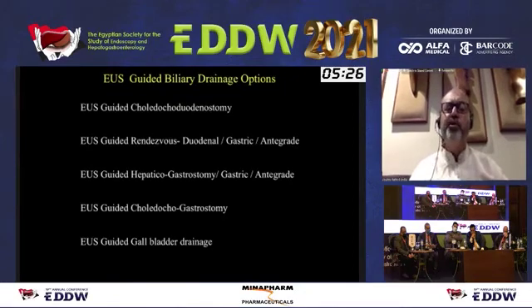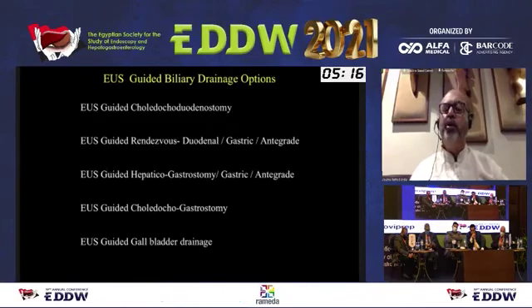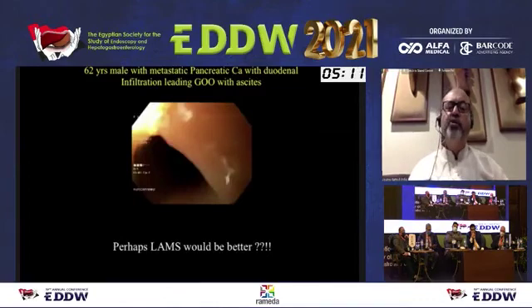So what are your biliary drainage options? We have biliary drainage options in the form of choledochoduodenostomy, a rendezvous technique, either duodenal, gastric, or antegrade. And you have hepaticogastrostomy, choledochogastrostomy, and direct gallbladder drainage.